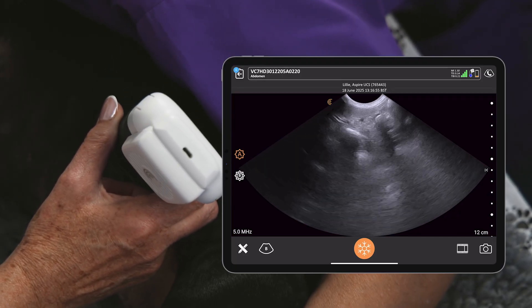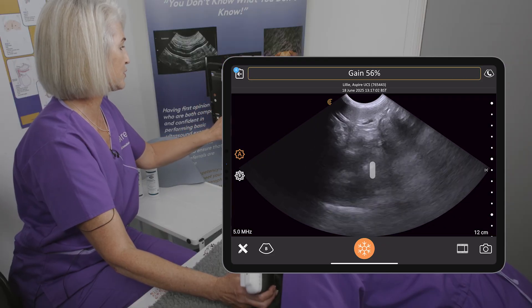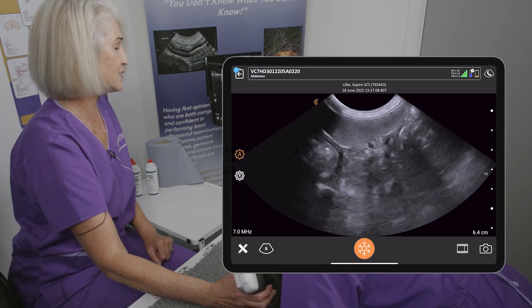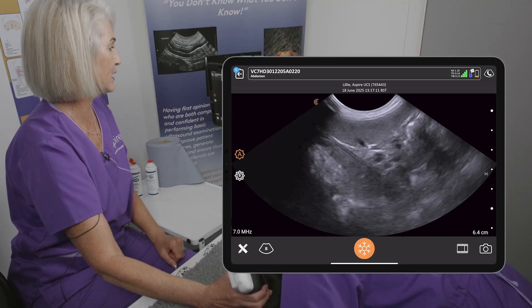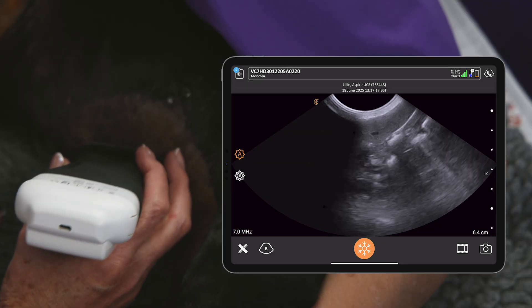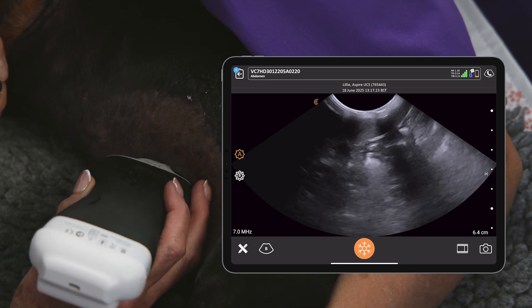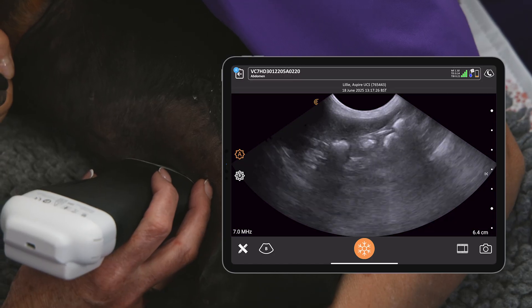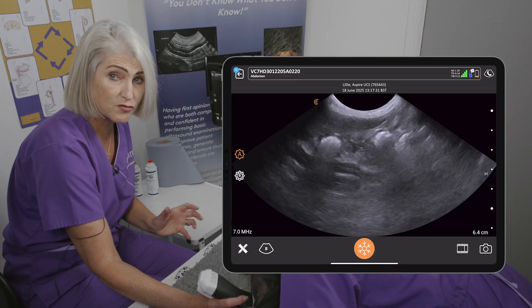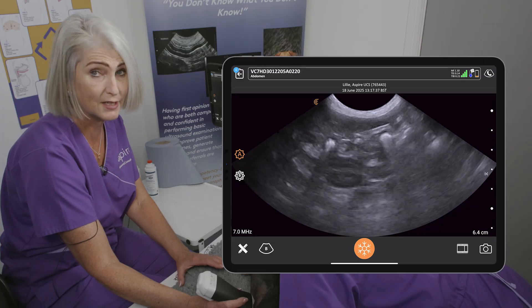This is a superficial structure — here is the spleen, so it's quite difficult to see if your depth is all wrong. The first thing I would do is map out whereabouts in the dog the spleen goes. I'm going to follow it now — with Lily I know her spleen comes all the way across here, this is still spleen, still spleen. Coming ventrally and just a little bit cranially we're seeing the tip. That nice pointy splenic tail is really important to assess, because if it's rounded or blunted that may be indicative of splenic enlargement or disease processes.